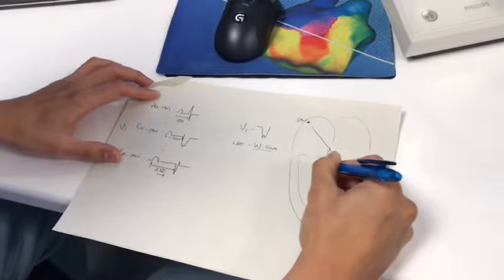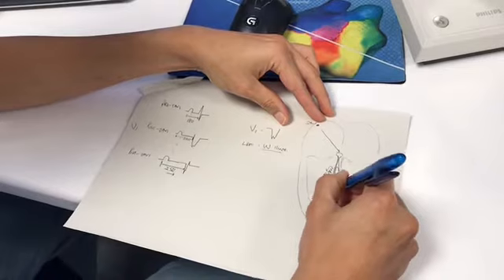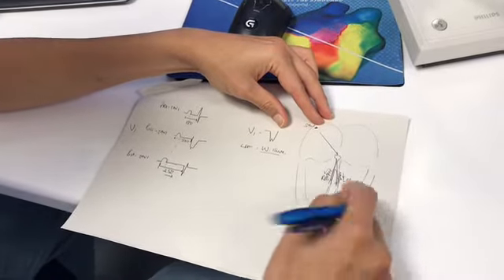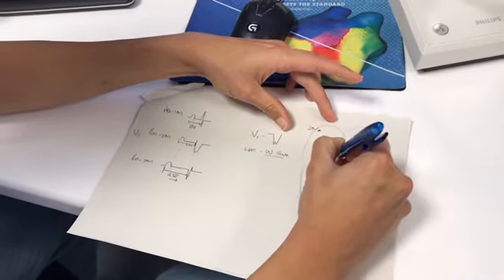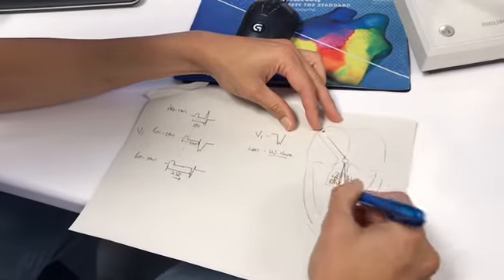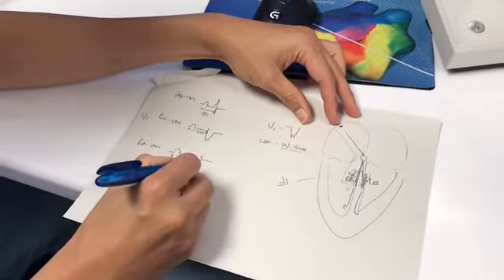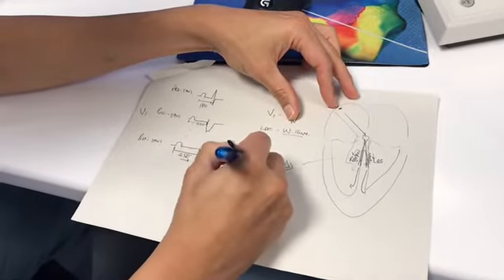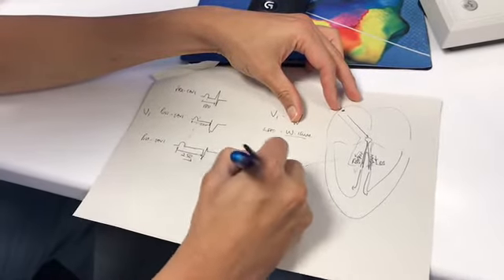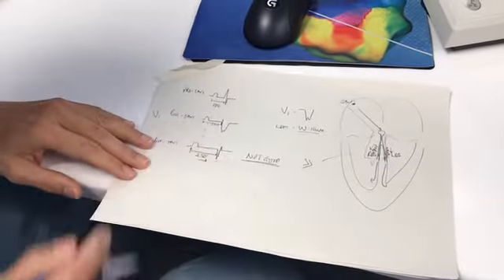And so when you have slow conduction in the left and the right, and therefore distal to the slow conduction you've got rapid conduction thereafter, you resolve the left bundle. And so you no longer have a left bundle, but what is the time taken to get from the SA node to the point of resolution? This is longer. So when this is longer, you have an apparent resolution of left bundle, but with a prolonging PR interval, this is not a good sign, not good. And therefore, instead of saying, left bundle's resolved, can we discharge? No, you think, may need to pace.